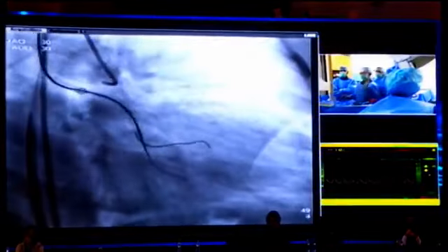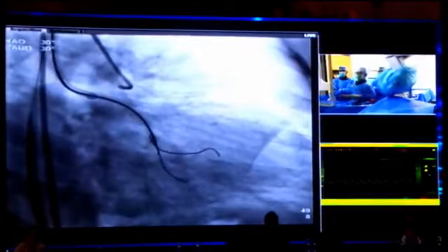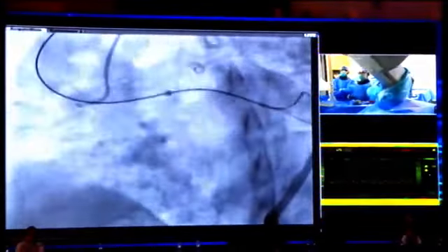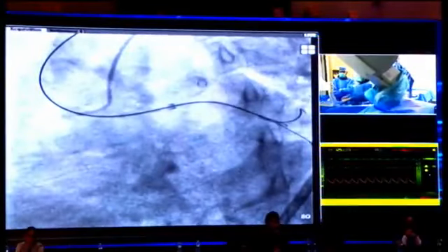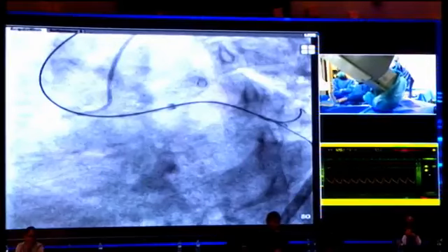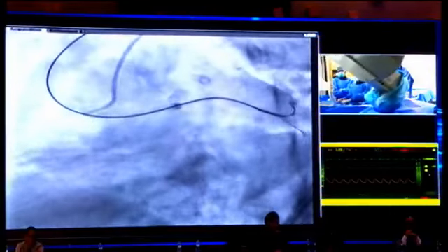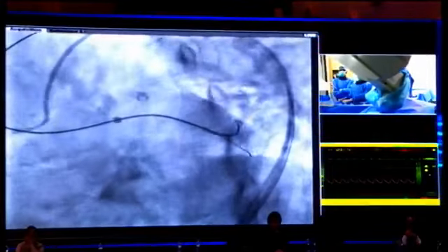Okay, and I will check another angle. Please move to the spider view to penetrate the distal cap. Yes. Already this wire, the Gaia second, is in the CTO body, but even using Sasuke with Gaia third cannot perform, so in this situation maybe switching to Conquest 3 is better, I think. From the beginning?